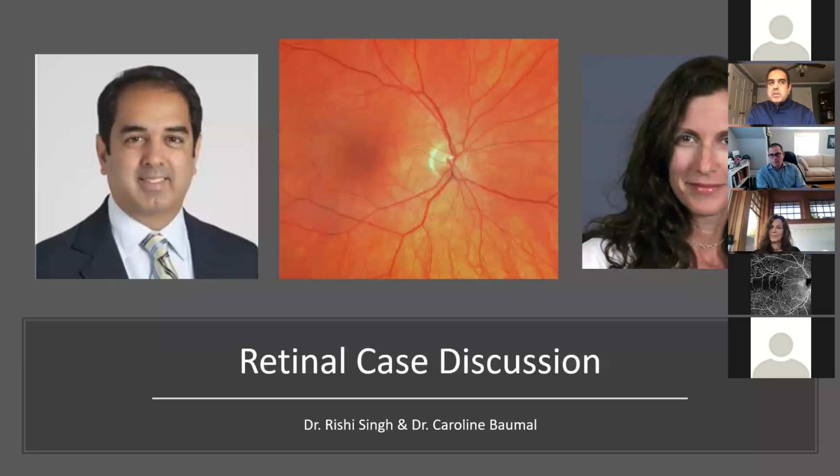Like there's lots of different things out there. Those are probably much better functional measures of visual acuity than we have. So what do we do? Because we don't have those functional measures right now, we rely on OCT, which is reasonable. I think at better visual acuity levels, the OCT has become so discordant with those visual acuity levels that it's not a very good marker.